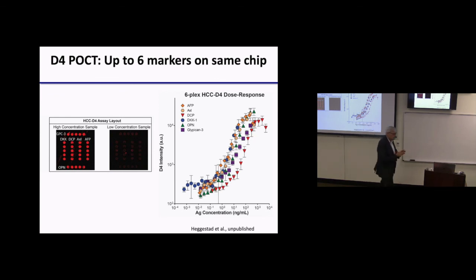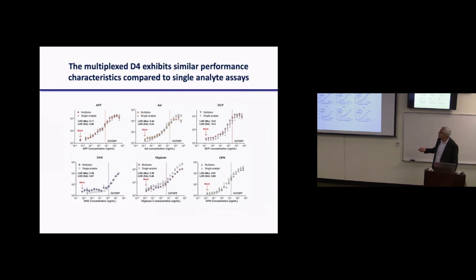So we built this 6 analyte array. Here's a dose response curve. The question is, can you actually build a 6 analyte array without cross-reactivity? Yes, you can. This is part of our whole screening exercise to find antibody pairs that are highly sensitive and not cross-reactive with any of the other antibody analyte combinations. If you do it by ELISA, this will take you years.